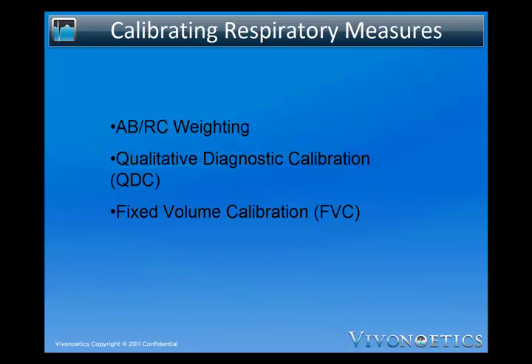VivoSense automatically applies a default calibration upon import of a data file. This calibration weights the AB and RC bands with equal unit weighting and scales the average volume over the entire duration of the session to 400 mL. Qualitative diagnostic calibration is used to weight the relative gains of each respiratory compartment and should be applied prior to any other calibrations. QDC calibrations may be applied automatically or manually. Fixed volume calibration sets the overall gain of the volume signal so that the average breath volume over the calibration period is equal to an externally measured breath volume. This may be from a fixed volume bag or a spirometer. It is recommended to apply a FVC calibration following a QDC calibration.